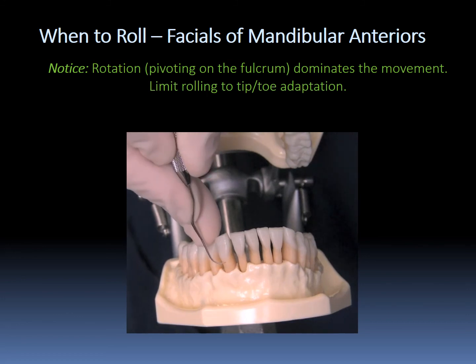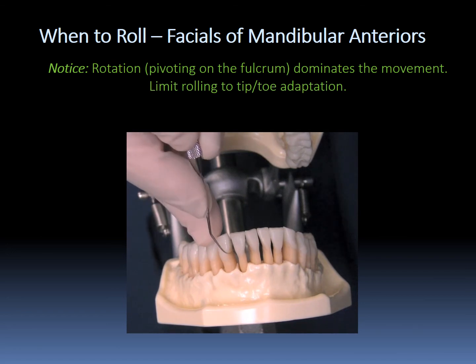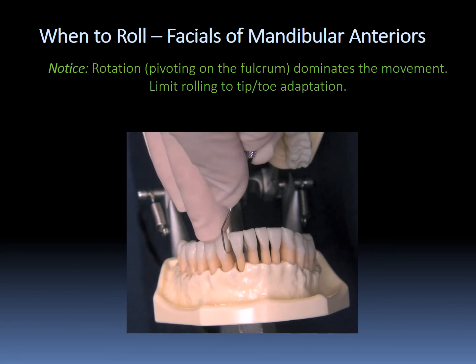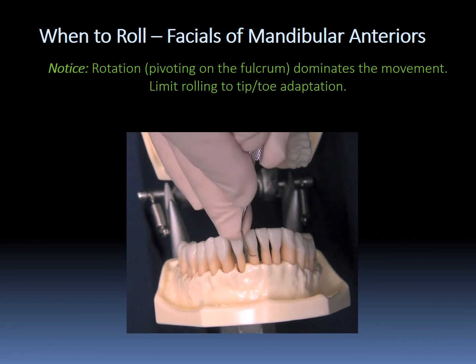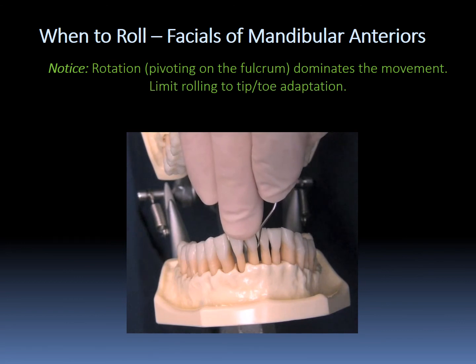By establishing a fulcrum over here on the right side, and then we're going to start on the facial of the right canine with very small overlapping strokes, and then we're going to come over to the mesial of this tooth, and I have to lean my handle over. You see how I'm moving the handle over to upright the lower shank. We'll do the next tooth. Start on the facial with very small overlapping strokes, rotate around, and then again upright the lower shank as you come around. And we'll do the next one. Rotate around, upright the lower shank.